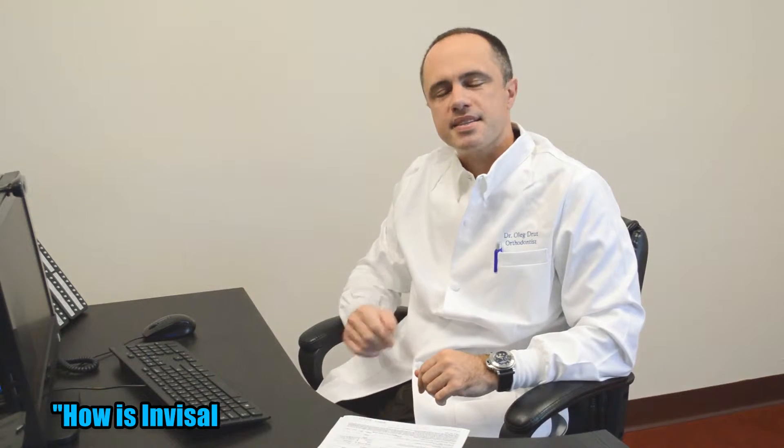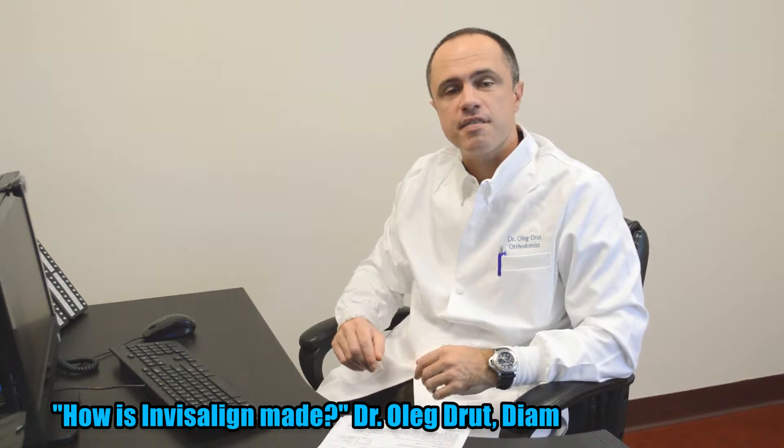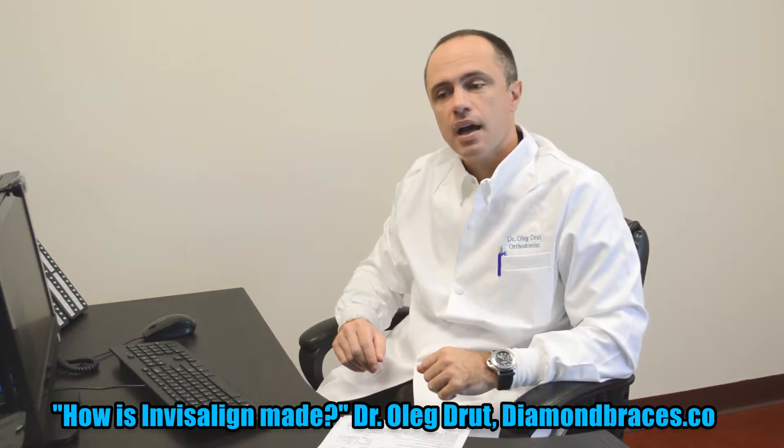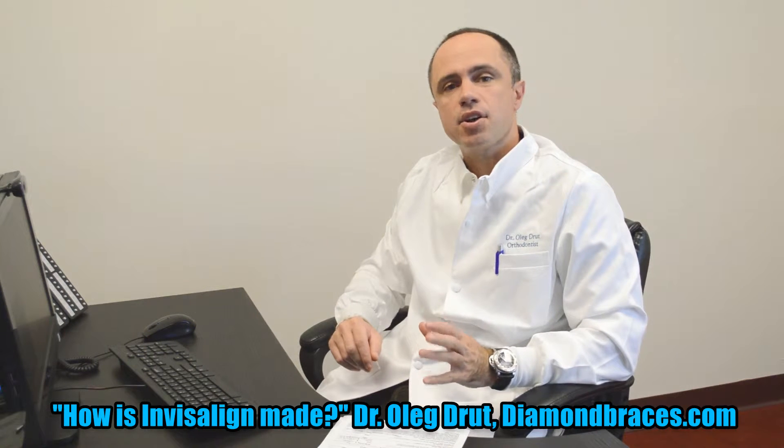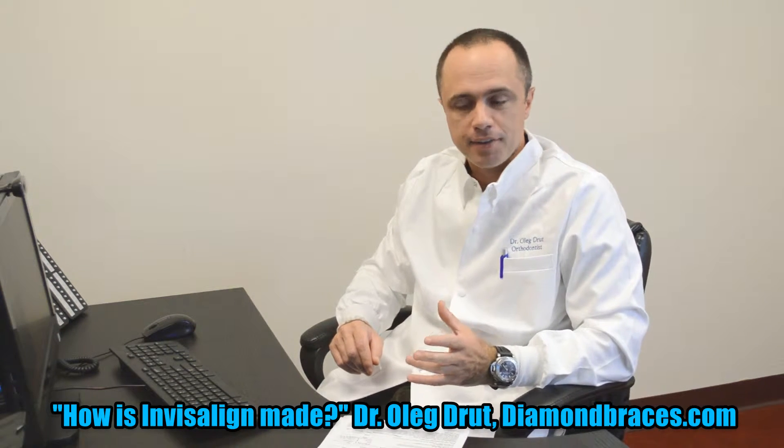Hello everyone, my name is Dr. Oleg Drude, I'm an orthodontist, and today's question is: Invisalign — how it's made. First of all, when you come to the doctor, the doctor will take a series of X-rays and impressions of your teeth, or a scan of your teeth.